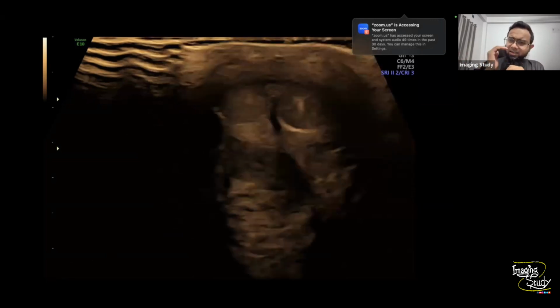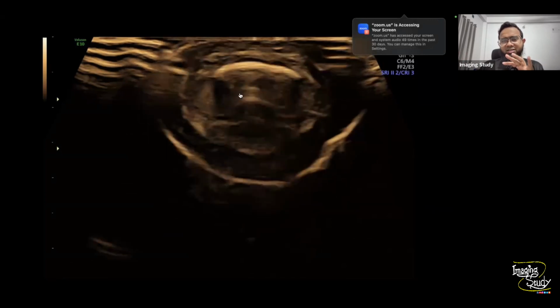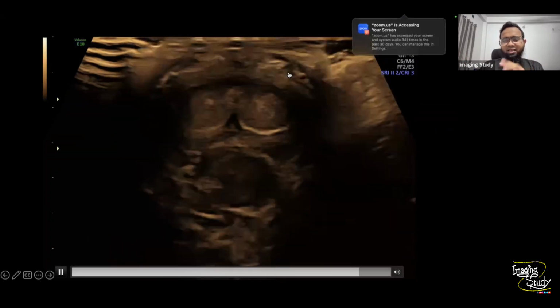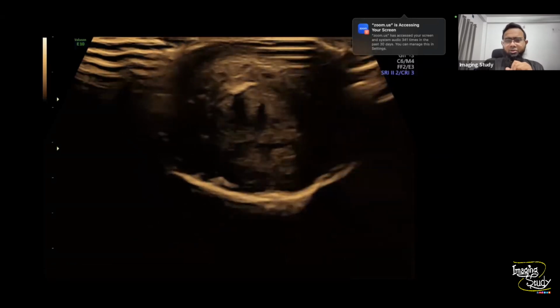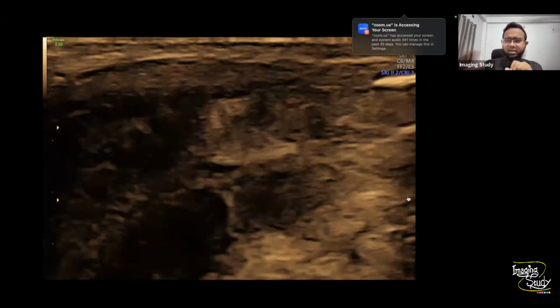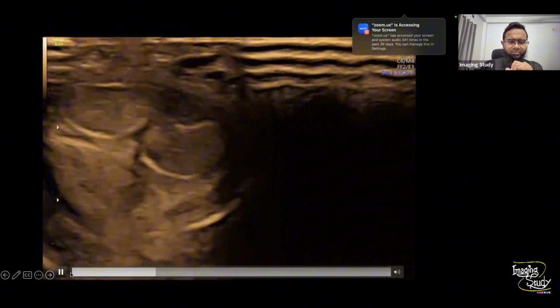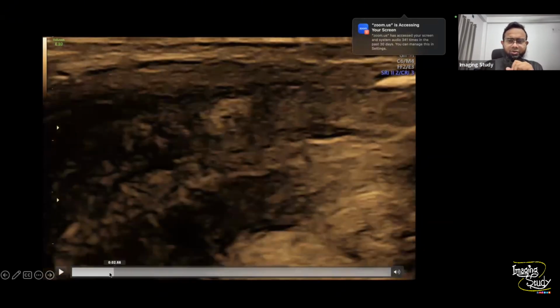So always try to say where the plaque is located. Now, if you end the diagnosis just looking at this plaque, you will be doomed. There should be something else also. So let's see the long section image. Whenever we are checking the long section, we found something else. Just let me freeze the image at this point.